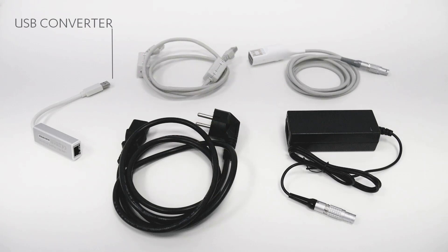The package includes a small USB to Ethernet converter, an Ethernet cable, the power adapter with matching power cord, and a smart cord.